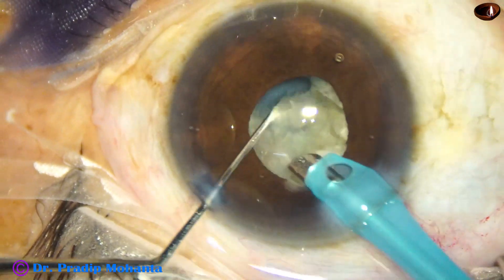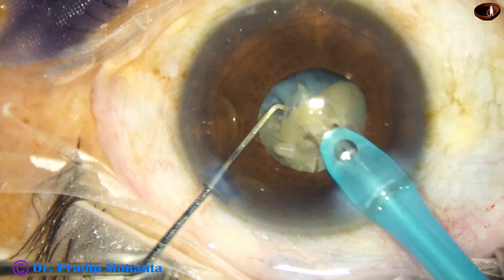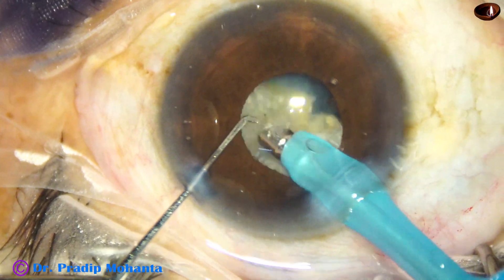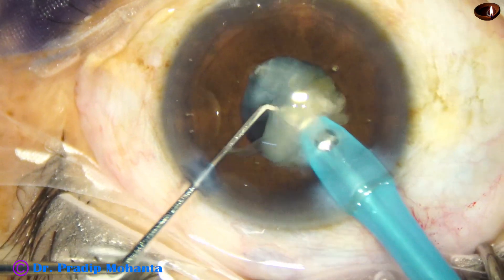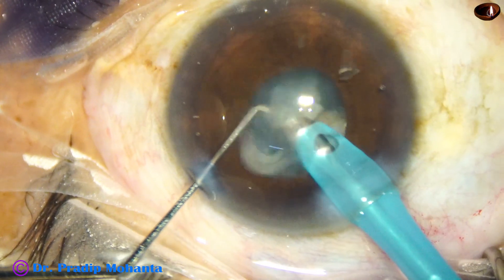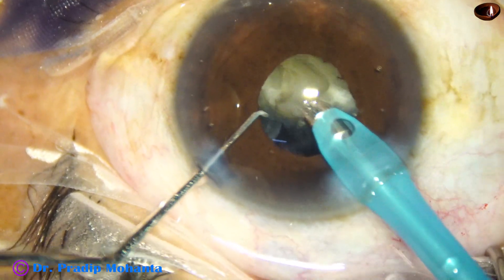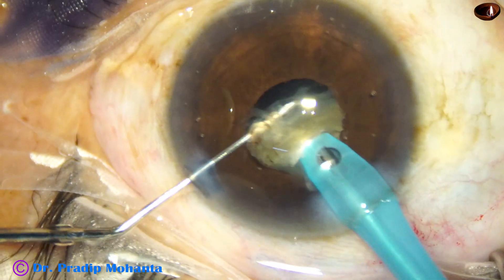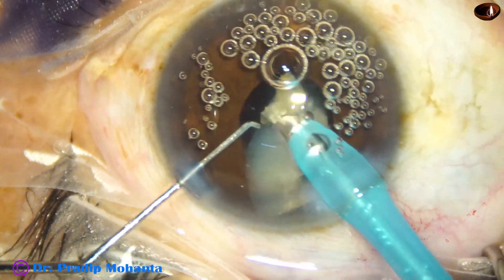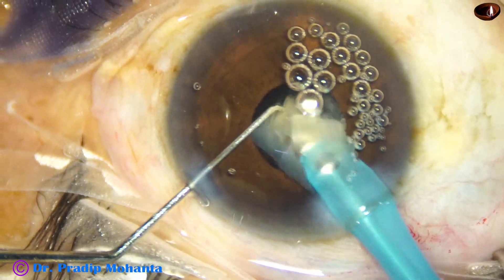Now I start emulsifying the pieces, and when I start emulsifying the pieces, the pupil starts coming down. At this time the size of the pupil is about 3.5 mm. I am keeping the handpiece at the center — the pupil is not floppy — so the chance of catching the iris is minimized if I place the handpiece at the center of the pupil.